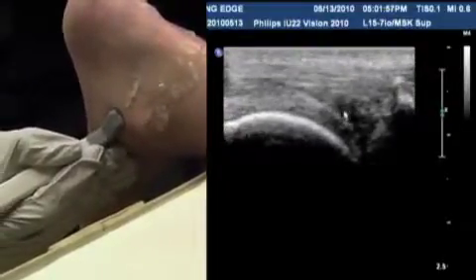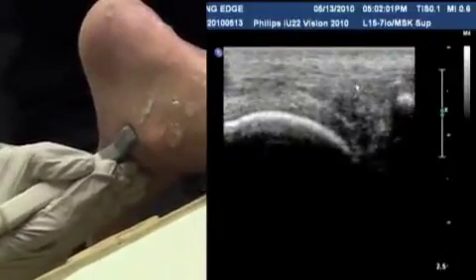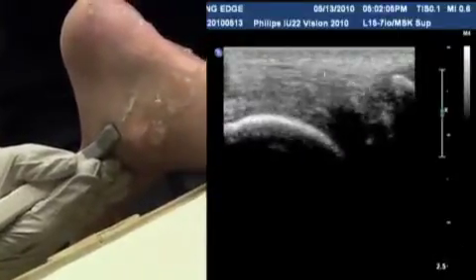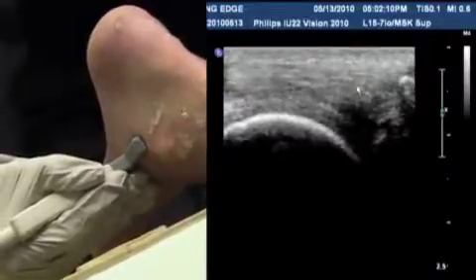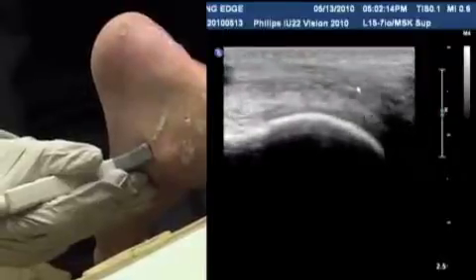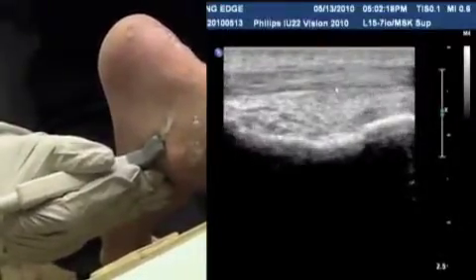These fibers, because they're spread out from the insertion point, it's normal for them to appear spread out. So what ends up happening in this case is you're getting the fibers going from top up here and bottom going down. So you lose that 90 degrees that you normally see within a tendon. Sometimes it's normal to see a little bit of fluid there. He doesn't have any, but sometimes you'll see a little bit of fluid, which is just normal.